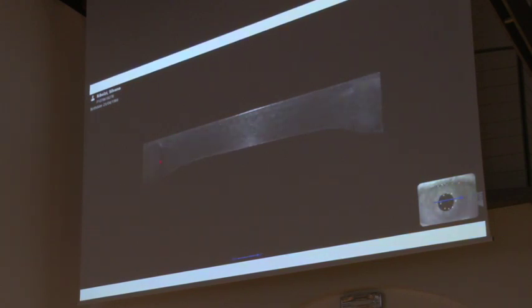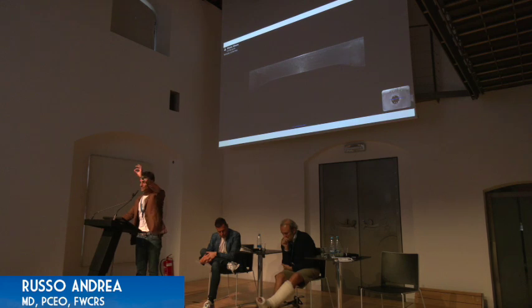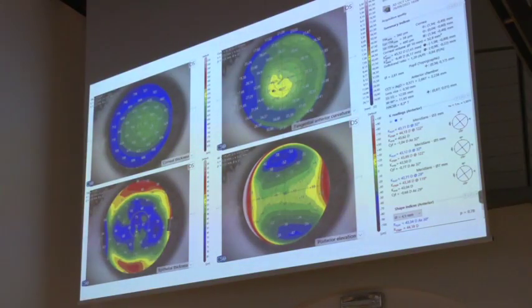So a new flap would be maybe a flap of 250 microns. So we decided to go ahead with a PRK in a case like this, because there was some melting of the original flap in the periphery, and relifting the flap was too dangerous. So PRK was the solution. But let me show you another nice case of intraoperative use of OCT.